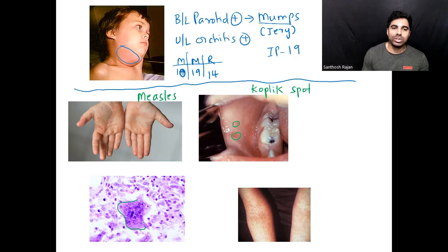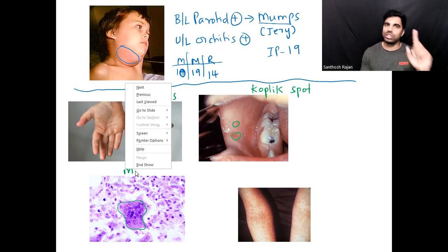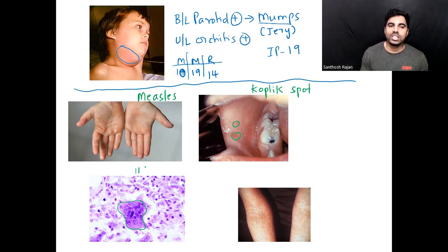This is again a multinucleated giant cell, a different form. You know, in herpes also we saw herpes simplex 1 and 2, varicella zoster, you see syncytia and MNGC. Here also, you see a multinucleated giant cell in the measles. What is the name of this? This is called Warthin-Finkeldey cell. You know this one. So this is also a question they can ask. M and W look the same. That is another clue. M for measles and W look the same. Warthin-Finkeldey.